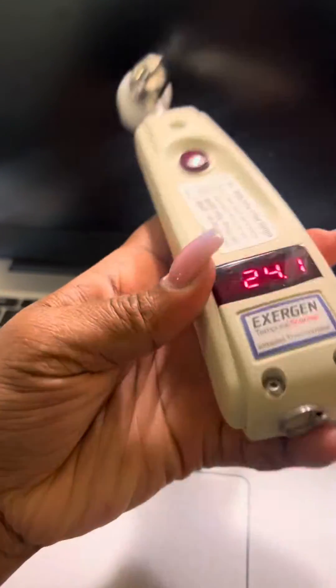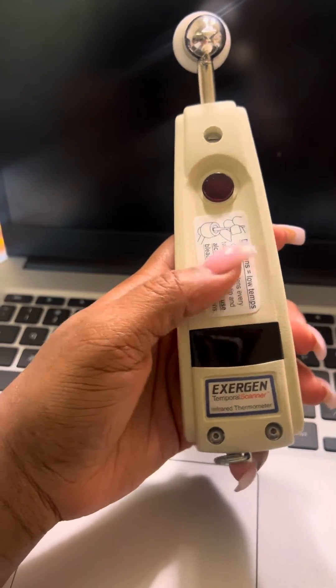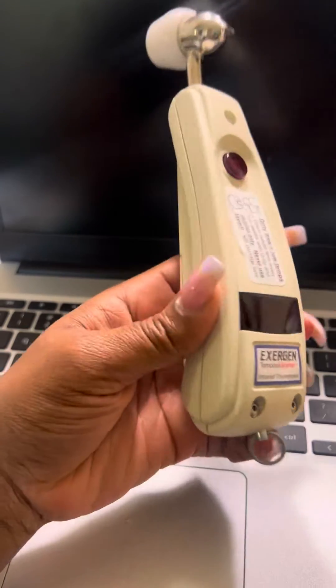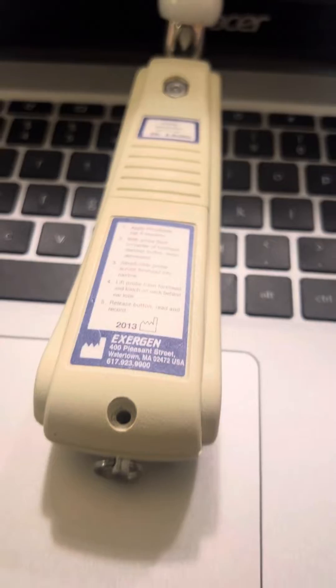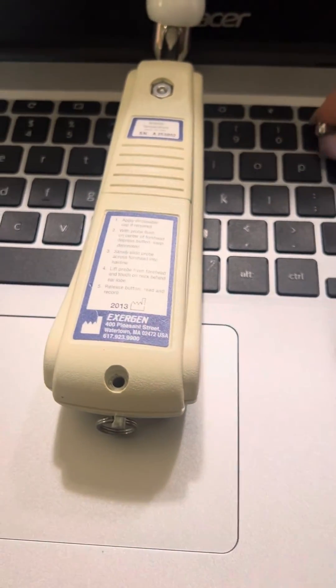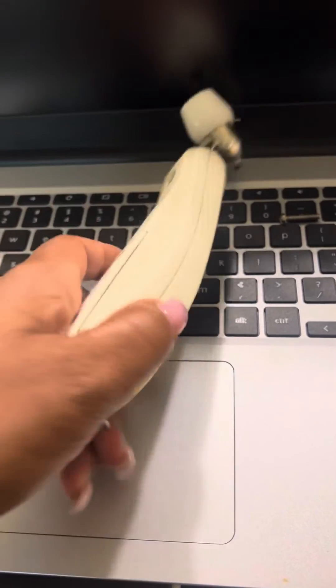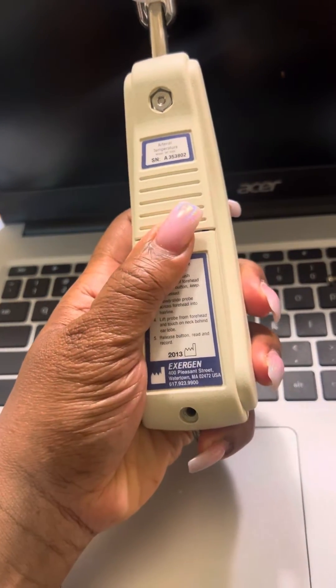It's reading in Celsius. So what you want to do, in order to switch to Fahrenheit, there is a screw that looks like this. You want to screw this out. I use a knife to take it out because it's like going to the garage and you pull it down.